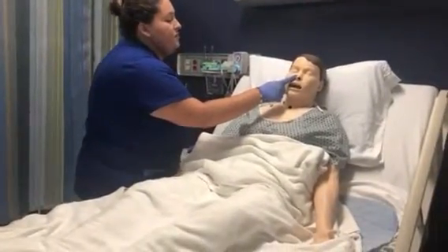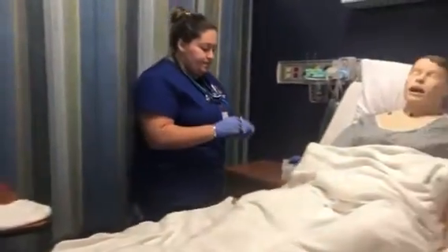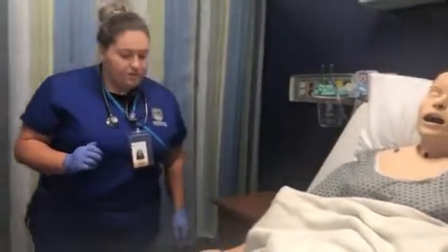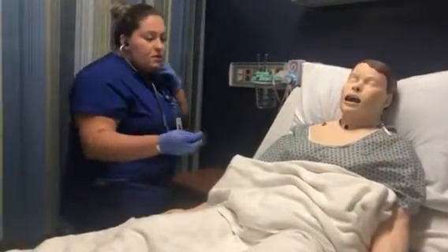Please just breathe in and breathe out. Breathe in and breathe out. Perfect. Gonna take the tongue depressor. Say ah. Great. Gag reflex is intact. It's present. And I'm going to auscultate. I'm gonna auscultate the lung sounds.